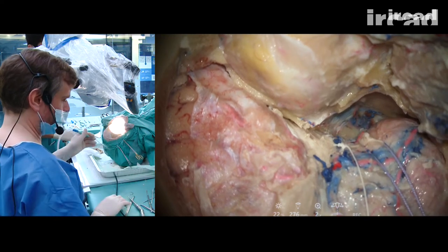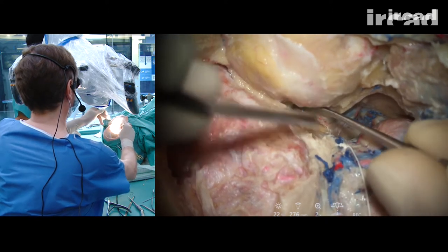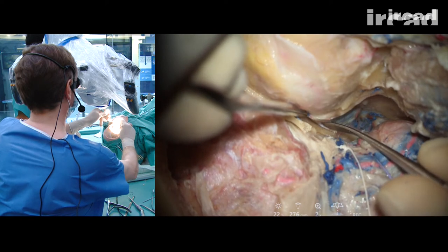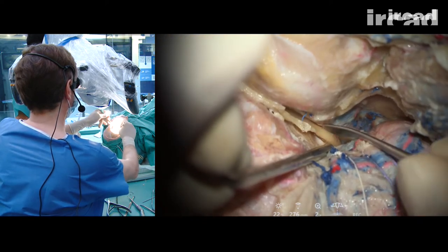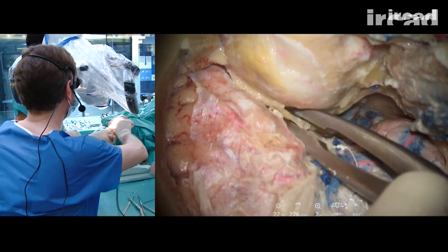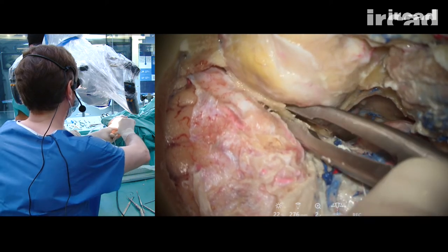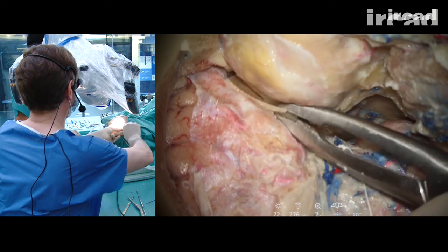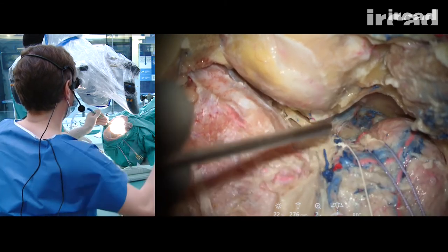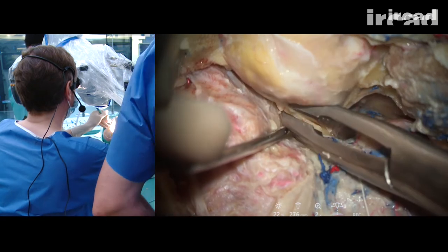So I can get a little bit more exposure of the base of the clinoid process here, because I have done an orbitotomy. And I can quite easily feel the end of the optic canal. Removing this piece of bone will give me additional exposure to perform the clinoidectomy.